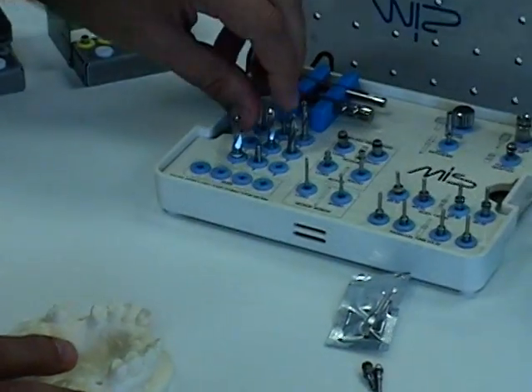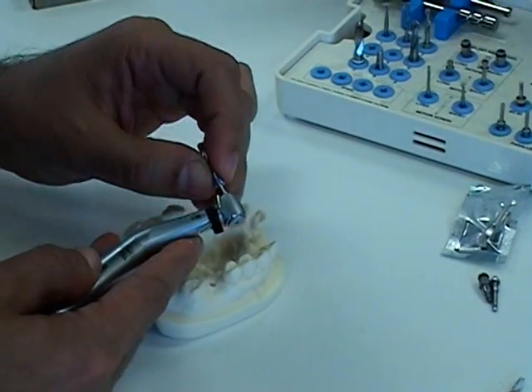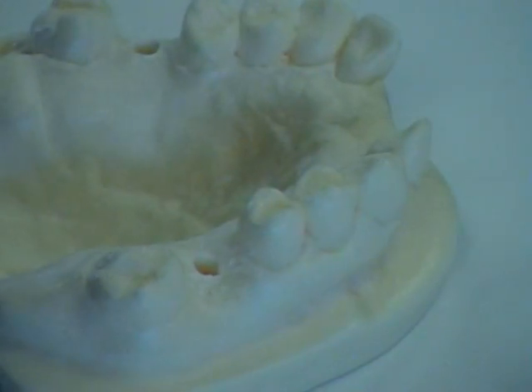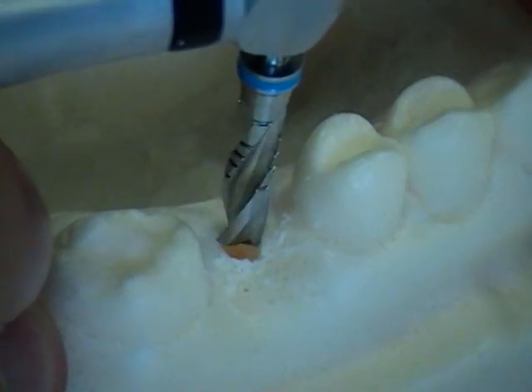The next one will be the 3.8mm twist drill, color-coded blue. Again, we are not using a drill stopper for this diameter, so we will be careful to insert it to the correct marking on the drill.